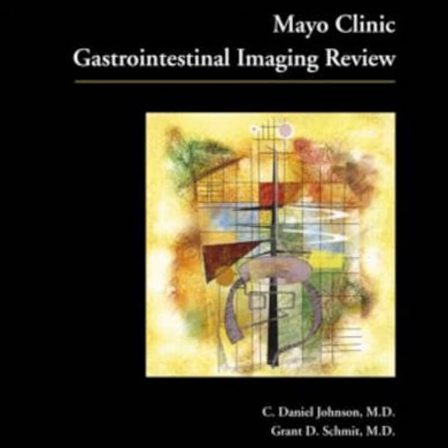But there is a massive diagnostic pitfall here, tied directly to gravity. Right, this is such a good pearl. If a patient is lying flat on their back for a single supine radiograph, the fluid pools in the rectosigmoid colon. Because it is anatomically dependent, it's physically closer to the table. So the fluid pools and the gas floats upward into the transverse colon. Exactly. So on the image, the rectum looks totally devoid of gas, which beautifully mimics a physical distal obstruction. It's a dangerous illusion. It could lead to completely unnecessary surgical interventions.